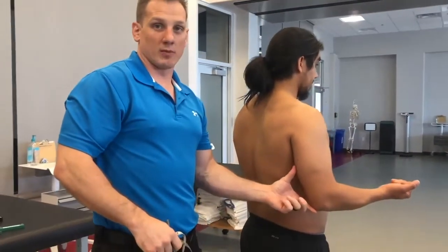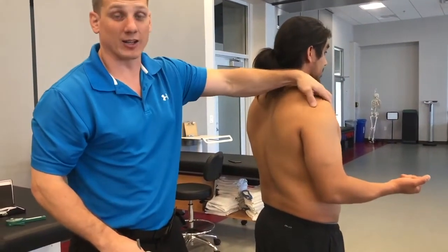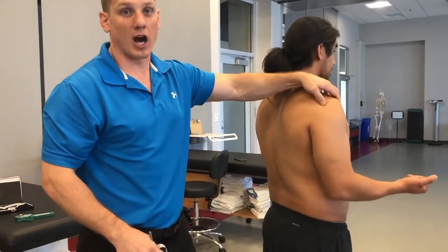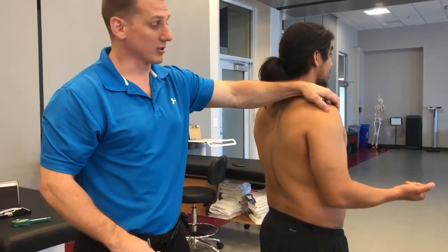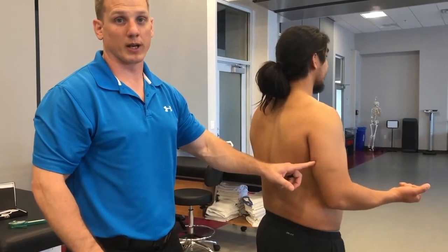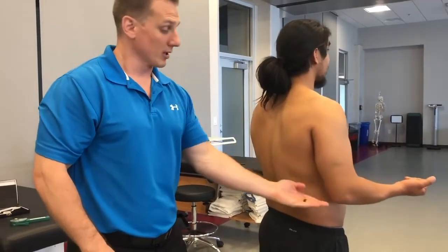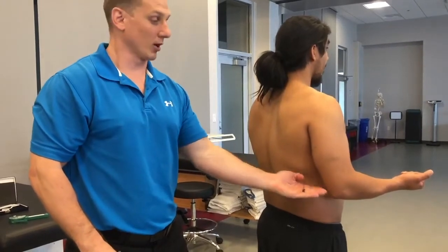We want to make sure we measure from the bottom up because his elbow is never going to change. However, if we measure from the top down, we have a higher likelihood of being off in our original location, which can raise or lower where our actual pinch is going to take place. To minimize error and help with repeatability, we want to measure from a more stable landmark up.